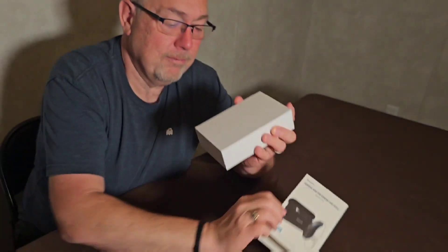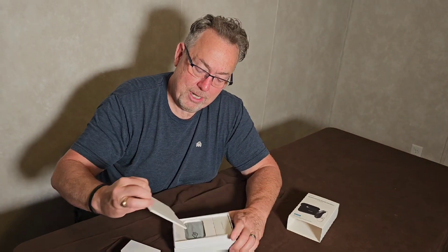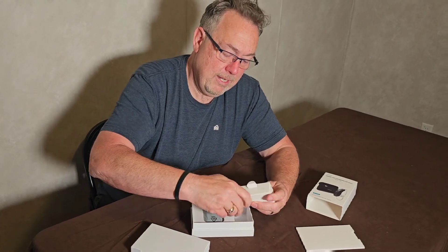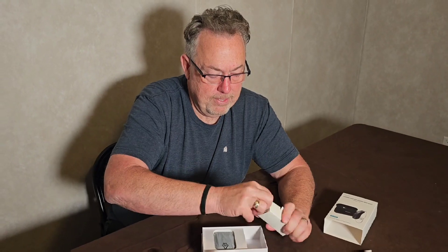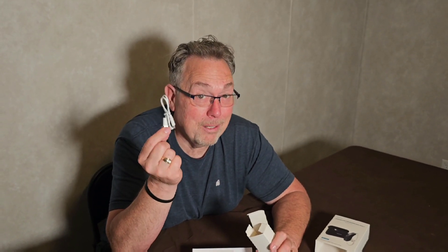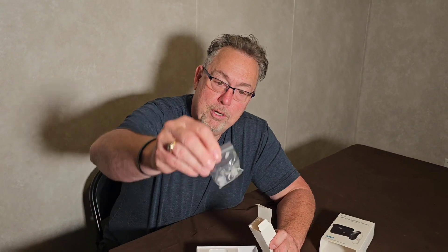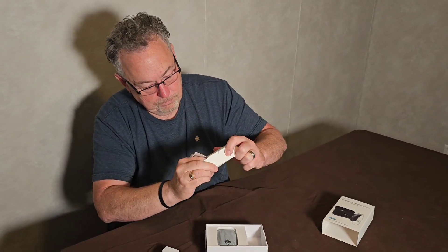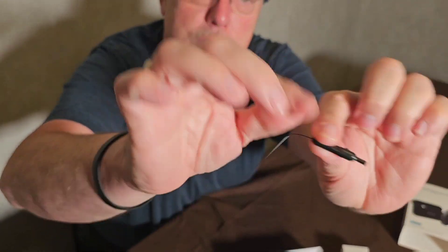These are actual hearing aids and these are really cool. First thing that comes up — and if you've watched any of my videos you know that I love instructions. Then you get an accessory box. In that accessory box you get a charger for your hearing aids. That means no more hearing aid batteries — that's a big deal. Then you get a bag with spare tubes and hearing aid parts, including the parts that go in your ear. And you also get a cleaner that cleans out the tubes, plus a little brush to clean out the other parts.